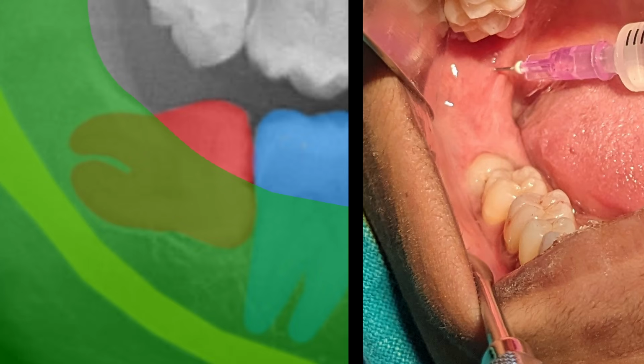This video is not going to be like my other surgery videos. I will not be showing you all the steps in detail. This video will be focused on how I section such horizontally impacted teeth.